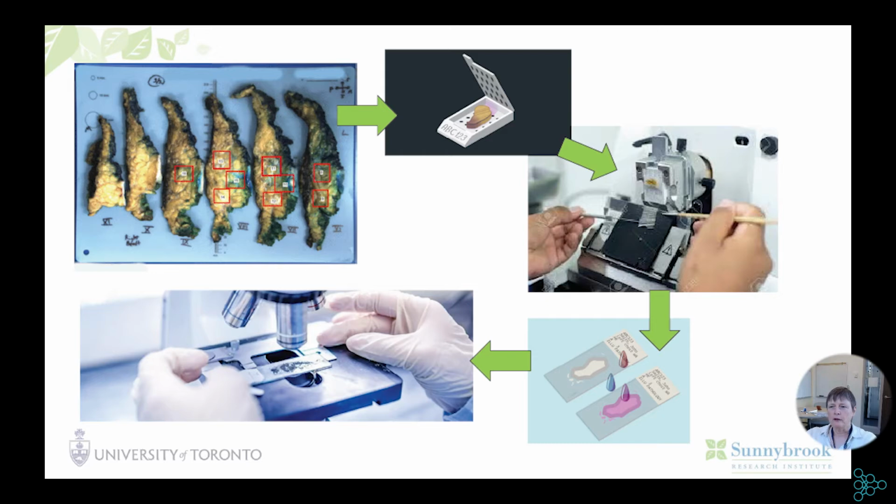So digital pathology, I'm going to go through quickly because it's not necessarily known to everyone. When you have surgery for, say, breast cancer, and this is a breast cancer example here, the surgeon removes tissue. This is actually a whole mastectomy here. These are called the gross specimens. So the pathology assistant will take the piece of tissue and carve it into these large bread loaf sections here. And then they'll take small sections from these tissue specimens, these little red boxes, and embed them in paraffin. This turns it into a solid block, so you can slice off these really, really thin slices. These are just a few microns thick.